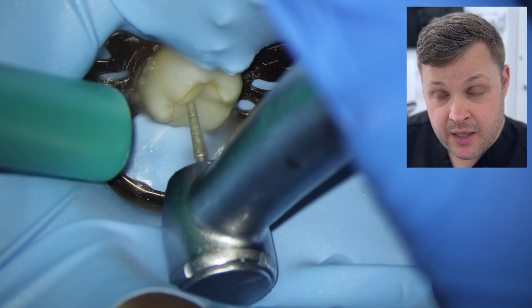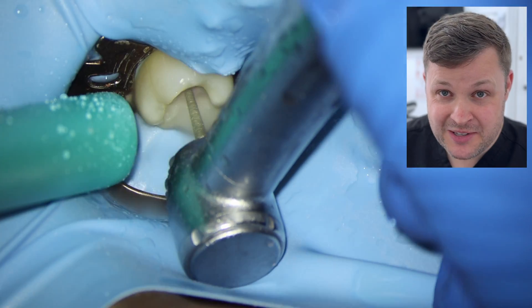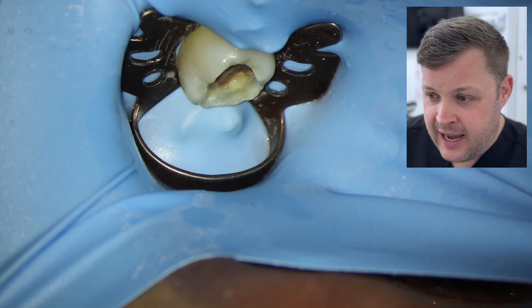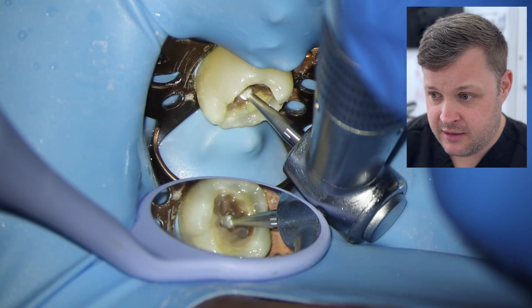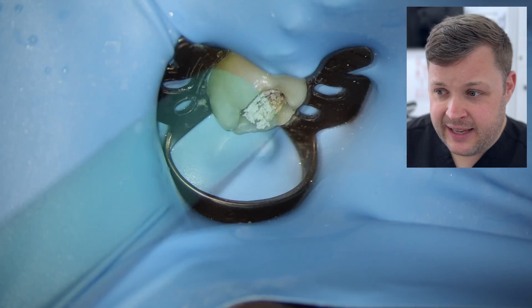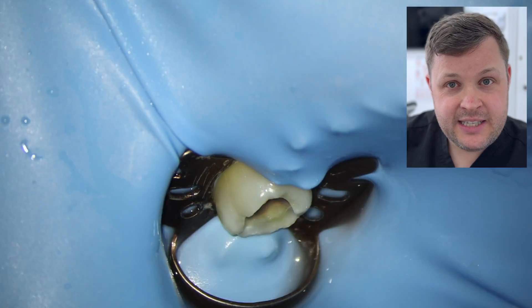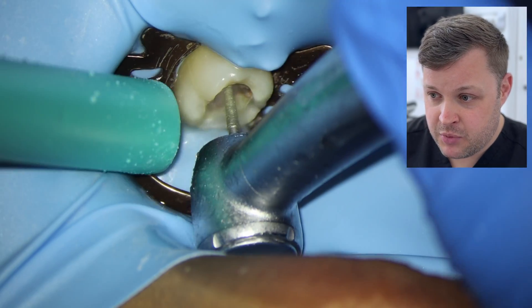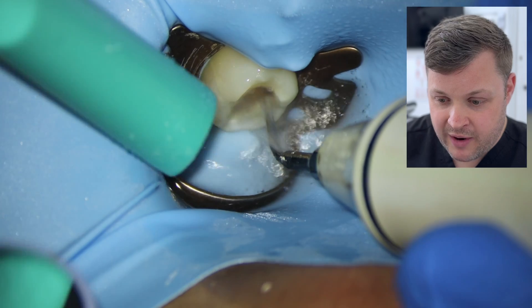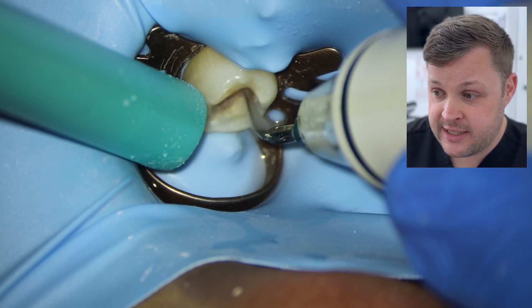What we're going to do now is remove the composite restoration. This actually looks like some sort of onlay, or maybe the edges are just raised and a little chipped. Initially I thought there was decay here, and when I used my slow handpiece it wasn't quite obvious that it was decay — it wasn't being dragged out nicely with the rose head bur. So I had to use a fast handpiece just to access the tooth. What I'm looking for here is a pulp horn or some portion where I can drop into the pulp chamber, because we know from the x-ray the pulp chamber is quite large.